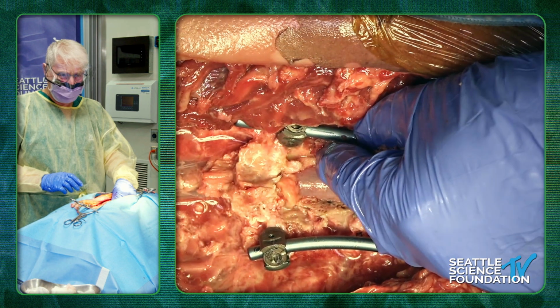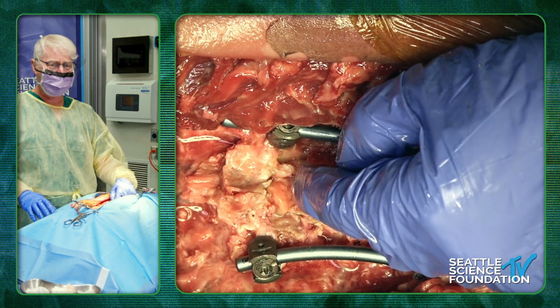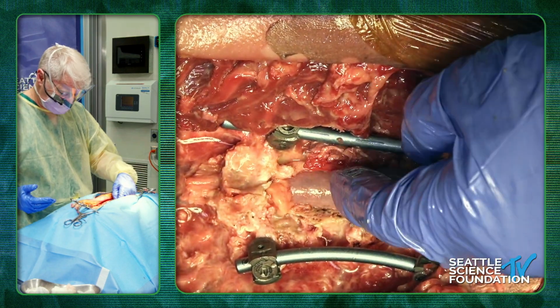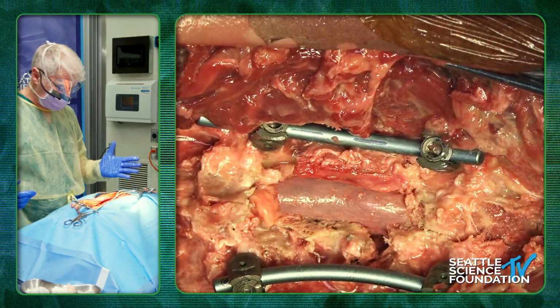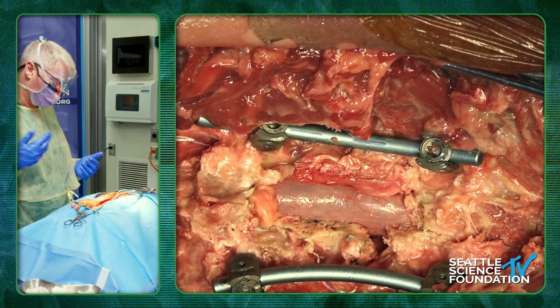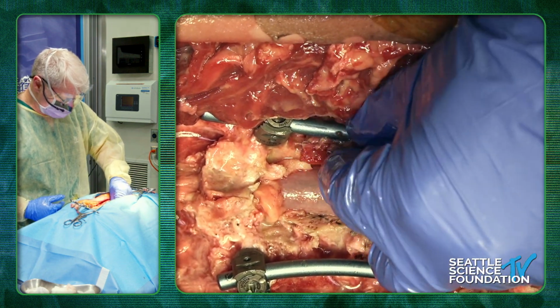I think at the end of the day, I consider it a release, like everything else you do with your rod. And so this is just a different form of release. And then what I'll do is I'll take my rod, bend it the way I want, secure it from the bottom, bring it to the top, and then I force all my anchors to the rod.